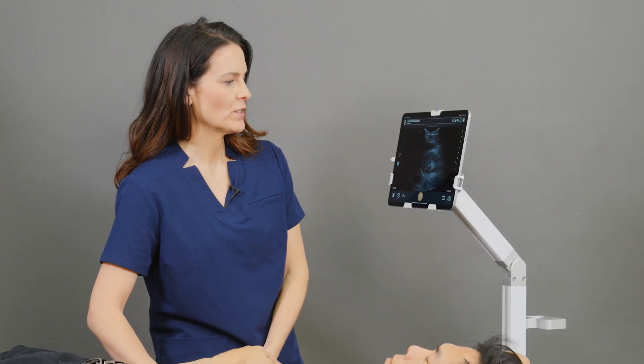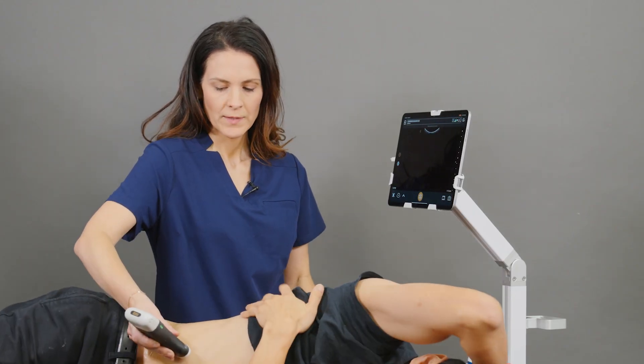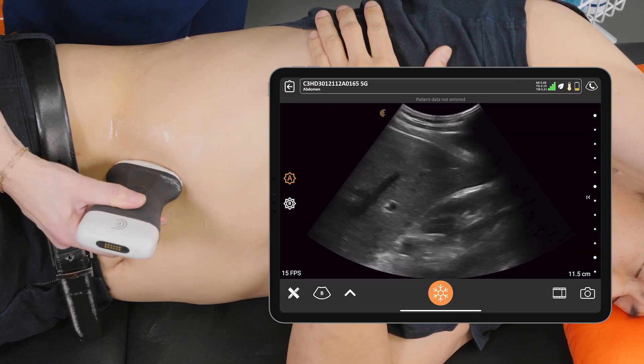Now I'm going to ask my patient to roll onto the side. Depending on your patient body habitus, you can try a few different positions to make sure that you're seeing the entire kidney.